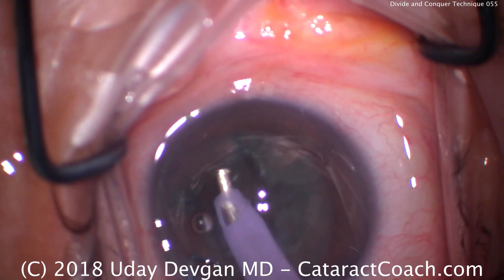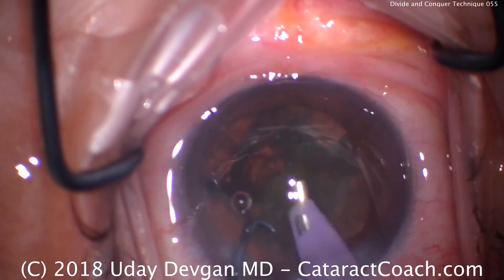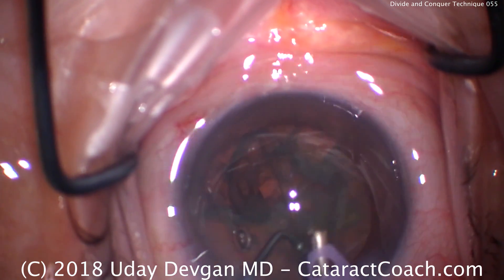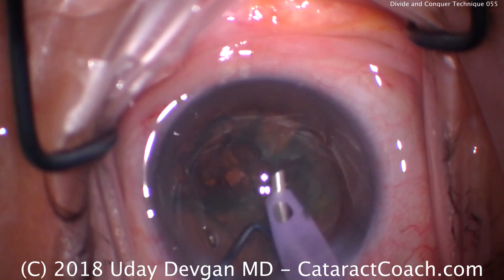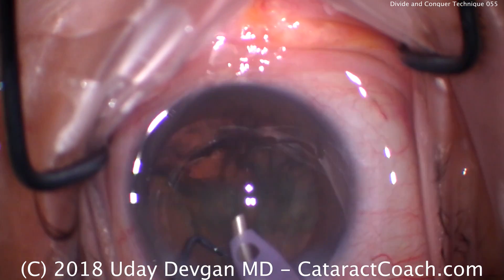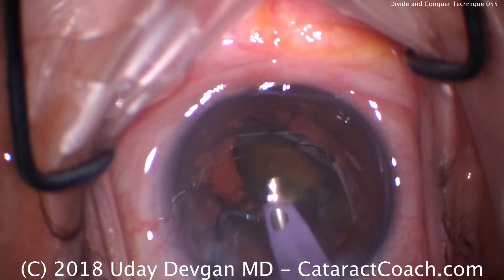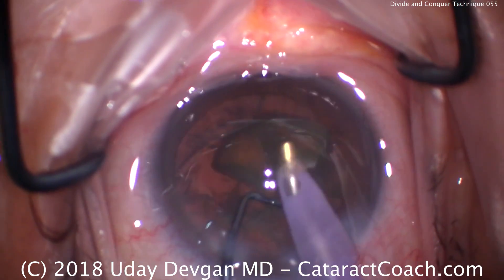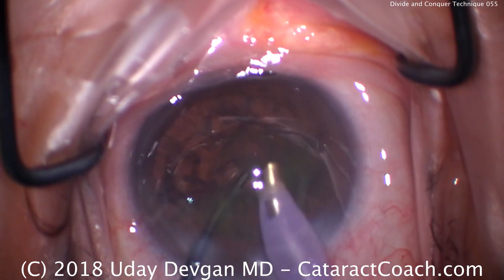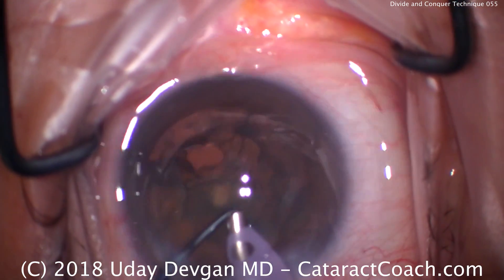Still keeping the phaco power the same, we can vacuum on a piece, bring it centrally, and emulsify that one piece. We can now go to the next piece, bring it centrally. Most of the emulsification of each piece is done away from the capsule — bringing the nuclear chunk to the center of the pupil at about the iris plane. Taking our time again removing the nuclear quadrant.